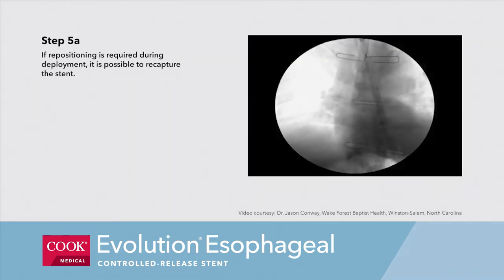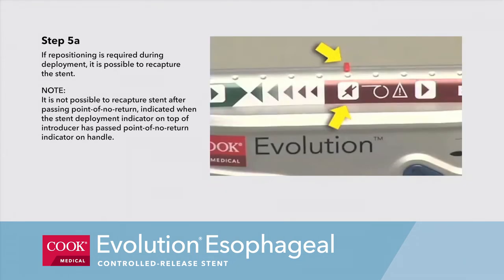Step 5a. If repositioning is required during deployment, it is possible to recapture the stent. Note, it is not possible to recapture the stent after passing the point of no return, indicated when the stent deployment indicator on top of the introducer has passed the point of no return indicator on the handle.